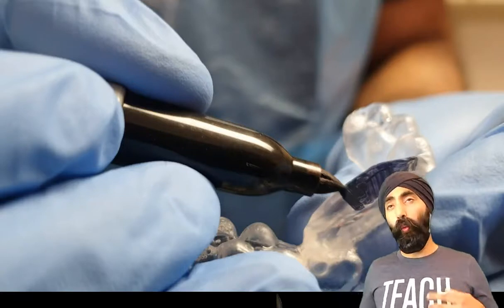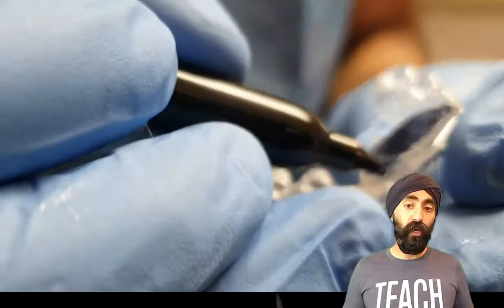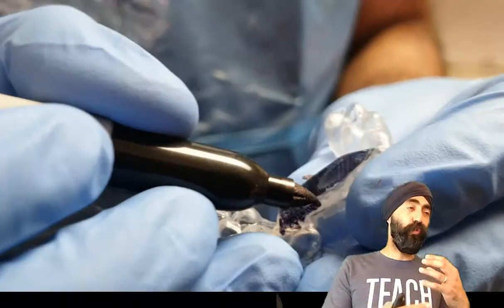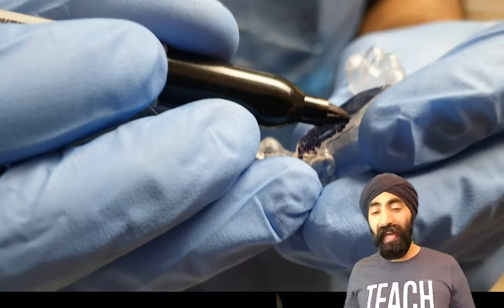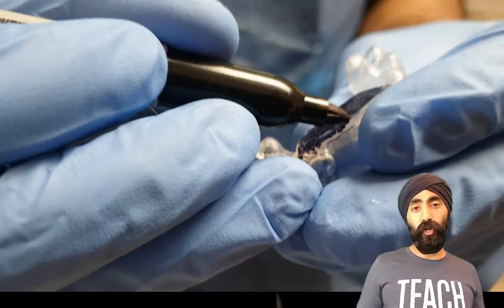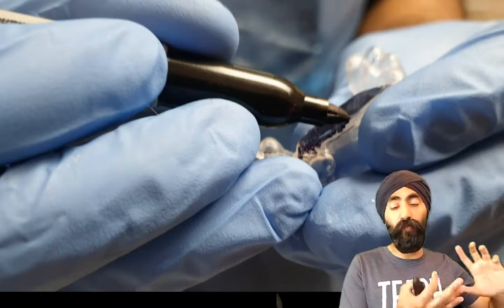And so one of the things that I do a lot of as well is I color in occlusal appliances, so that patients can see for themselves. Once they're committed to an occlusal appliance, we want to know, is the parafunction active? Because my case selection is pretty good, and I try not to over-prescribe appliances, I try and prescribe appliances to people who are actively parafunctioning, and there's a real tangible benefit for them to be had.